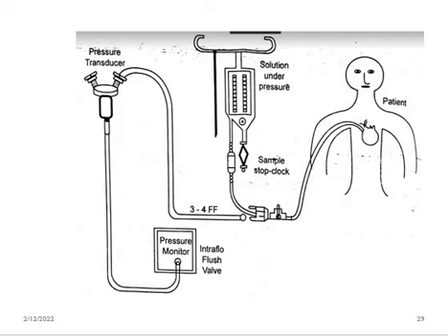This is the fluid filled catheter. In the case of the catheter tip probe, this arrangement is not required.